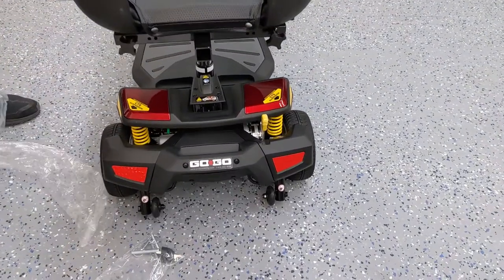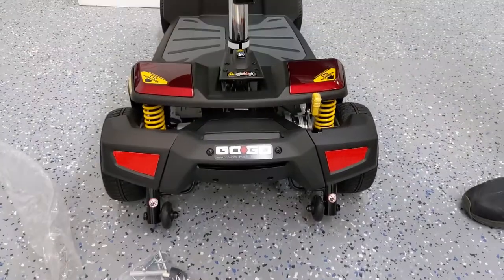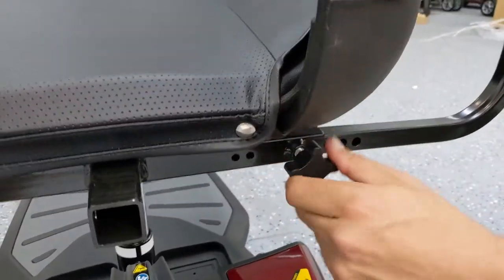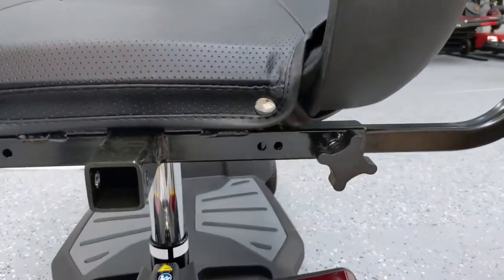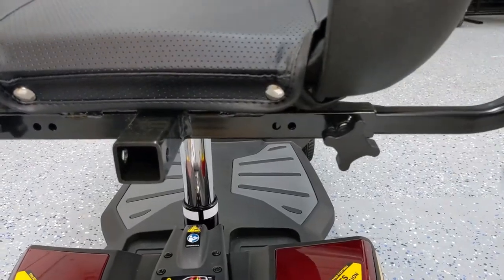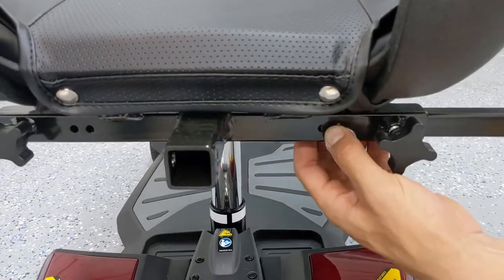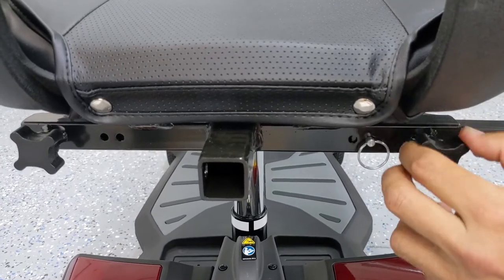Now I'm going to take the armrest and remove the plastic. On the back of the chair, you'll see that there are some knobs which you'll have to loosen in order for the rails to slide in for each armrest. You'll notice there are two slots. Go back to the keys and get the post pins that are thinner — these are actually for the armrest posts. Line it up, put the pin in, you have two options, and then tighten the knob to get that armrest to be firm.